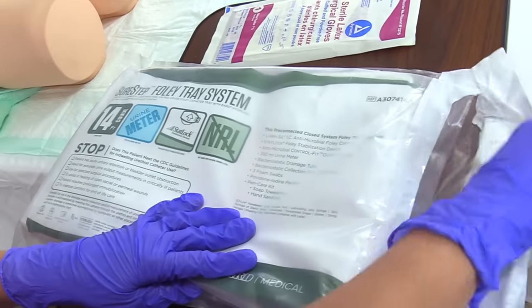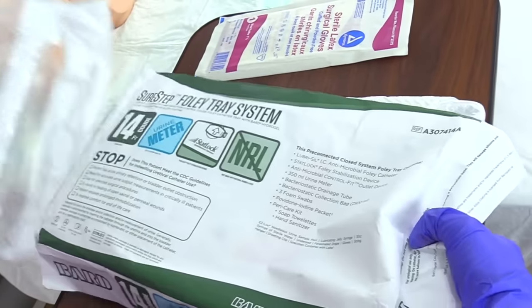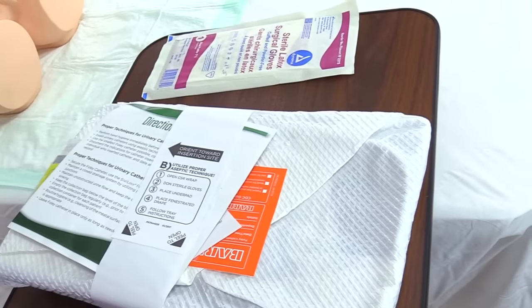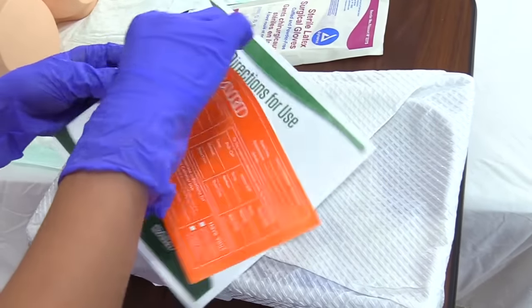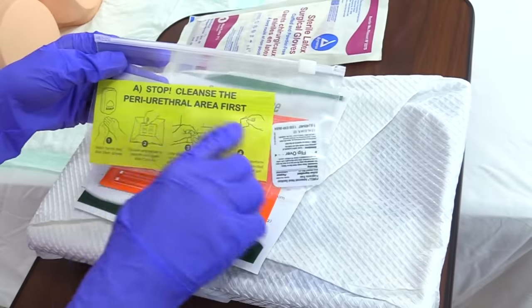I'm going to take this tab off and pull the kit out, then discard the bag to the side. Underneath everything are directions for use, stickers we'll use later, and the periurethral care supplies.